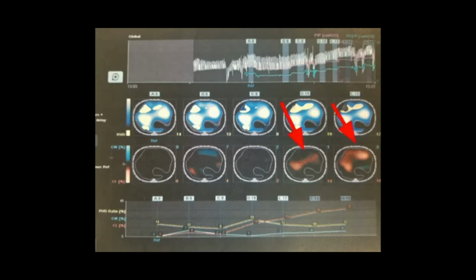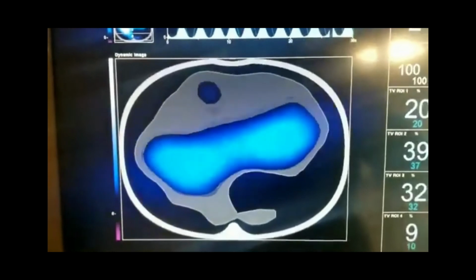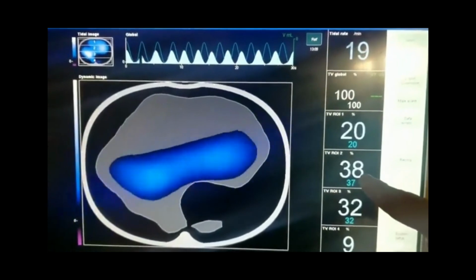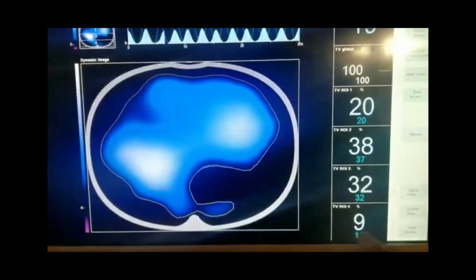However, with the orange that you can see over here, signifying over distension and a loss of compliance in that area, it wasn't an option to use that higher PEEP because it would have put in danger the ventral area of the lung to over distension. So here's just the full screen image that you can use when you're outside of the room. It's bigger, you can see it from far. And yeah, you still see the left dorsal area.